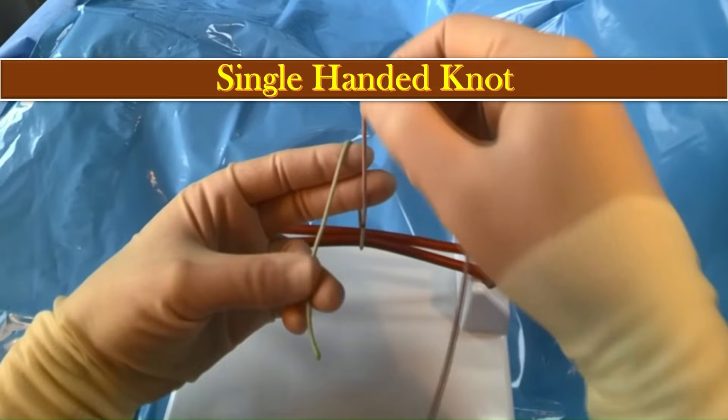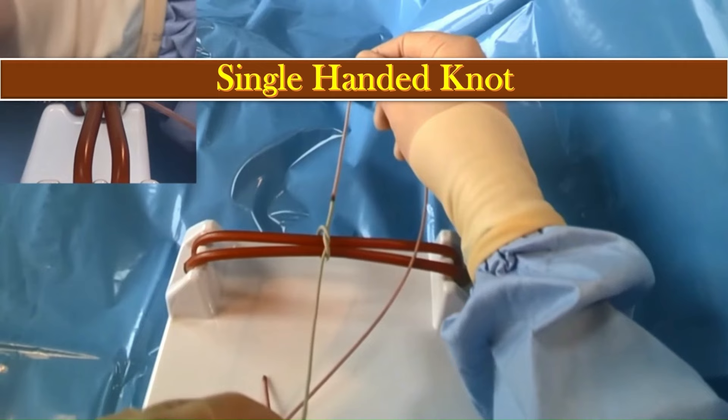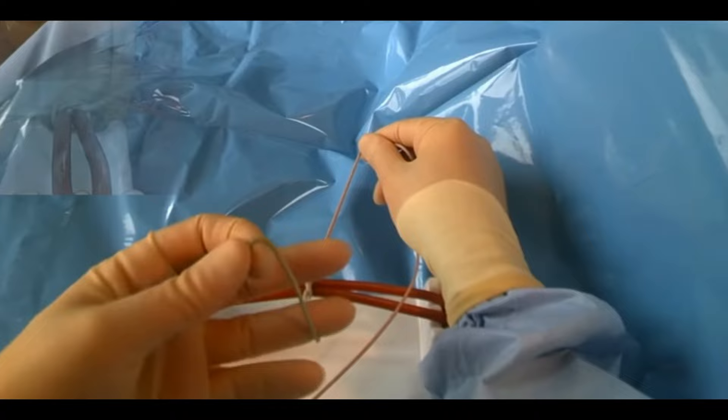Then bring the short thread up — over and then under. Then we come back the other way: hold the short thread between the thumb and the first finger, then bring the long thread down again. In this way, the short thread goes over, under, and down, and the knot is formed.